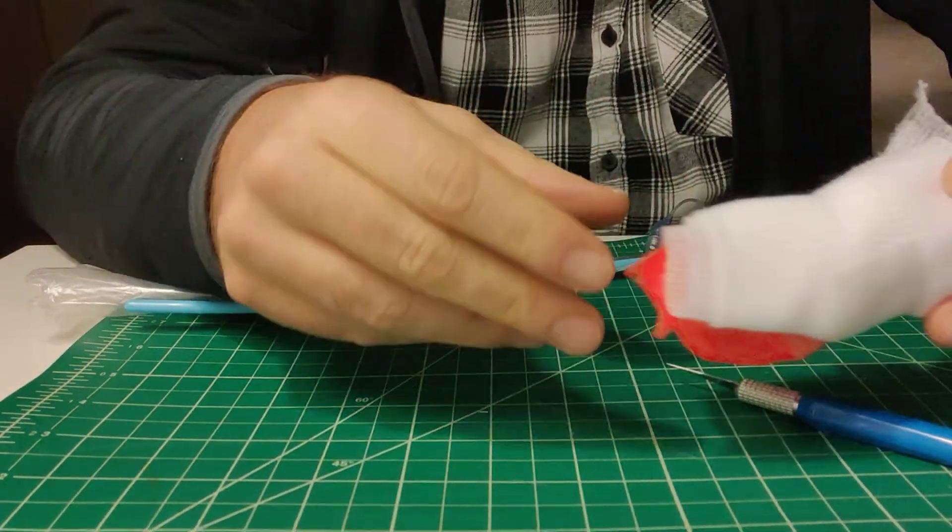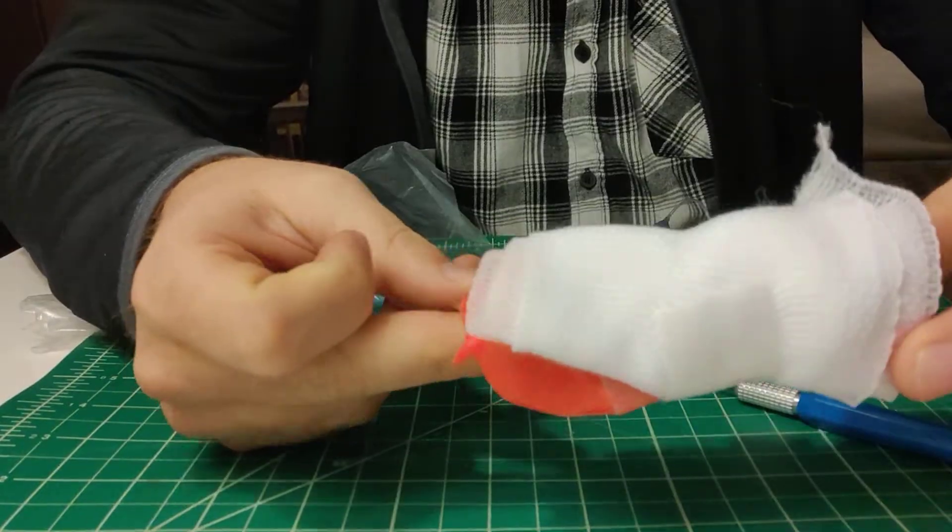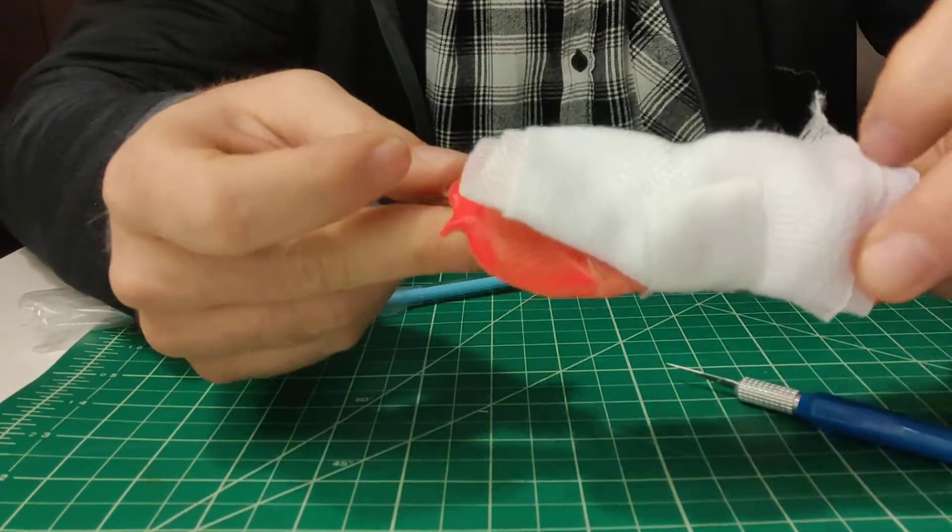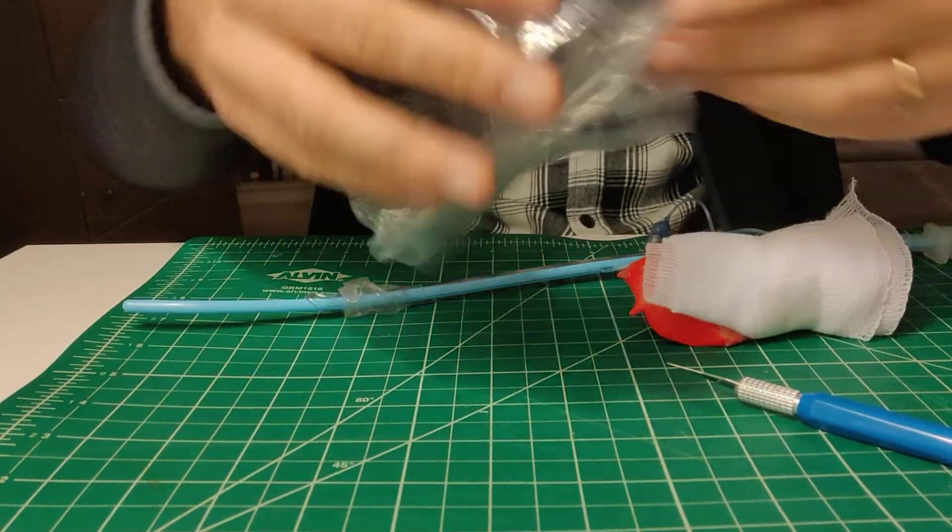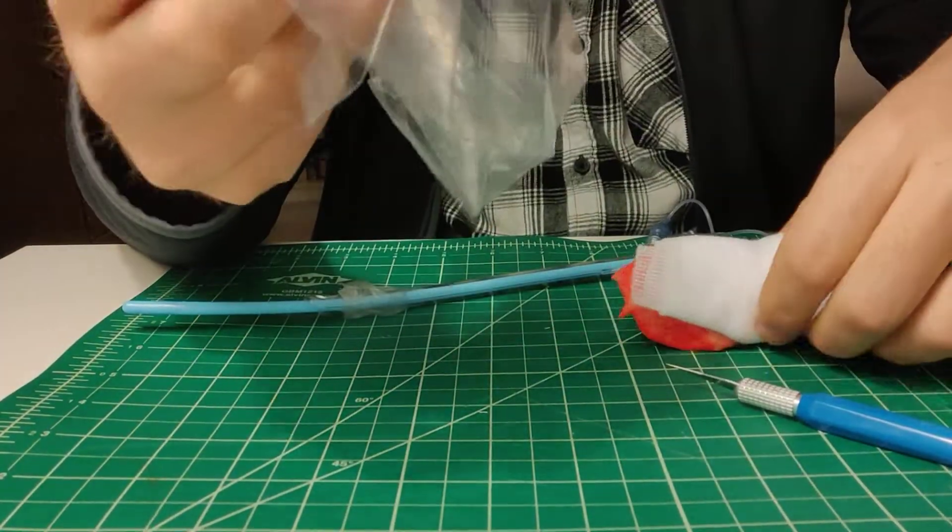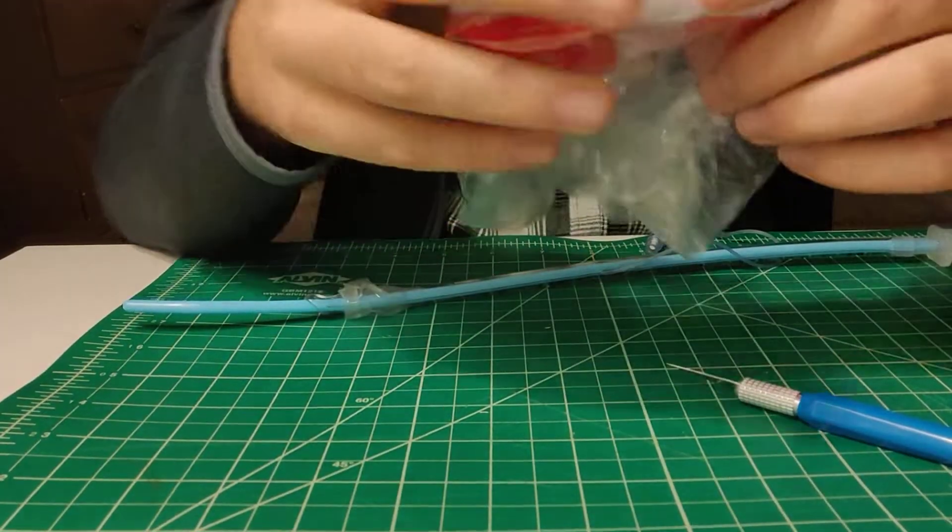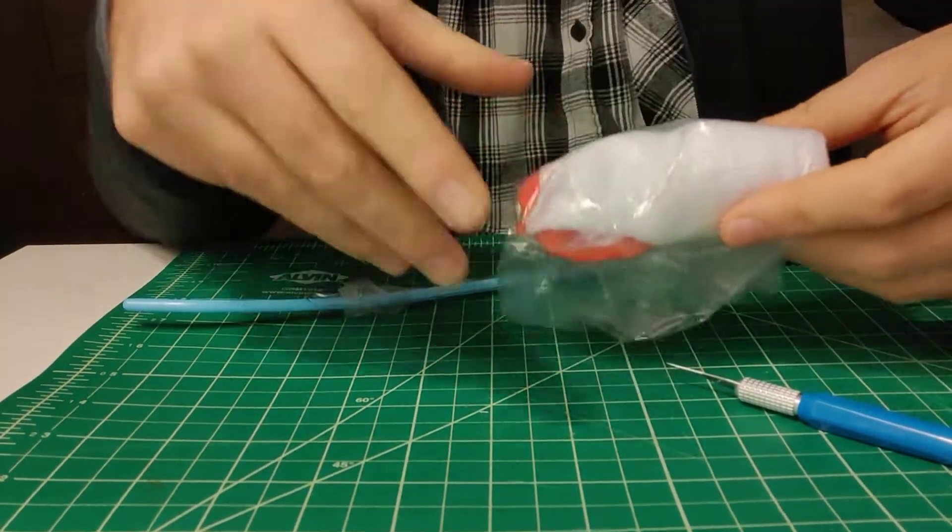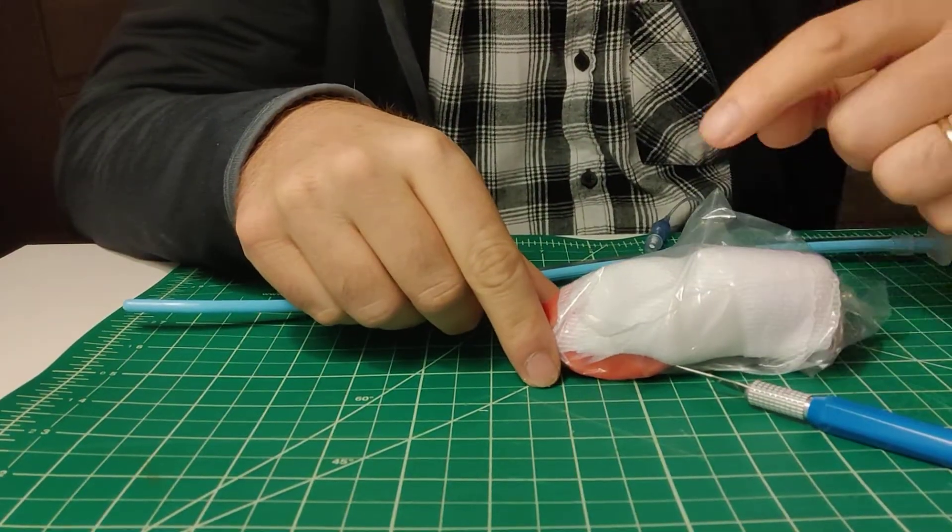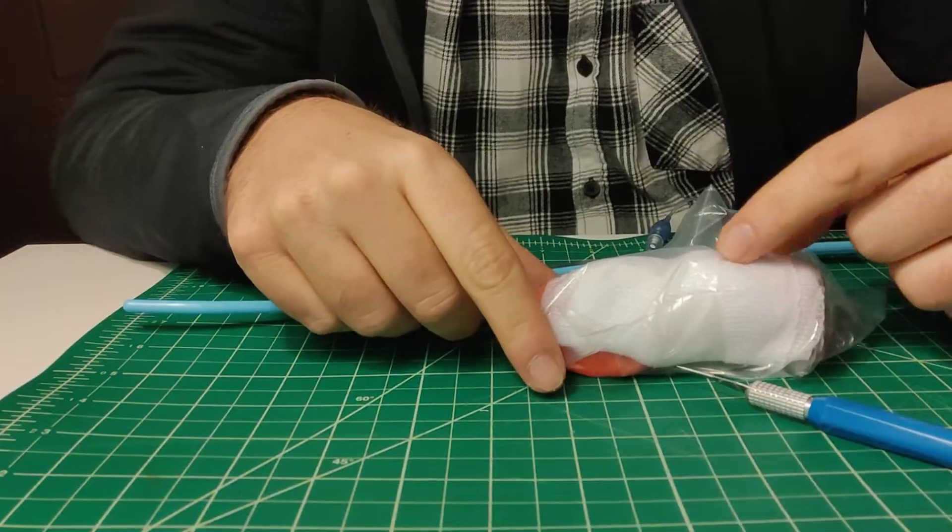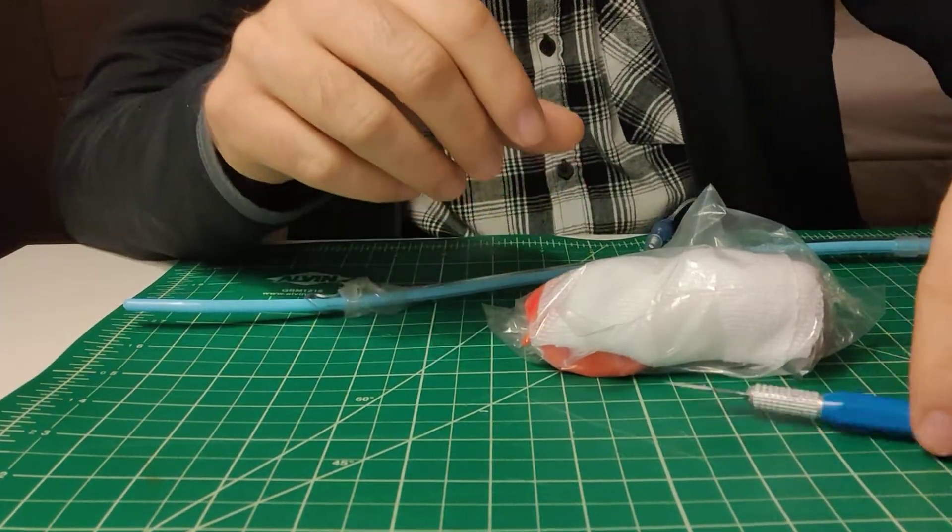And then you secure it in place with some tape. So now we have a crike with a cricothyroid and sub-Q tissue. The last thing is some skin and that's where your baggie comes in. You slide it inside the baggie and now you have a crike trainer that has been validated to teach you the motor memory skills so that you can perform in a high stress situation.